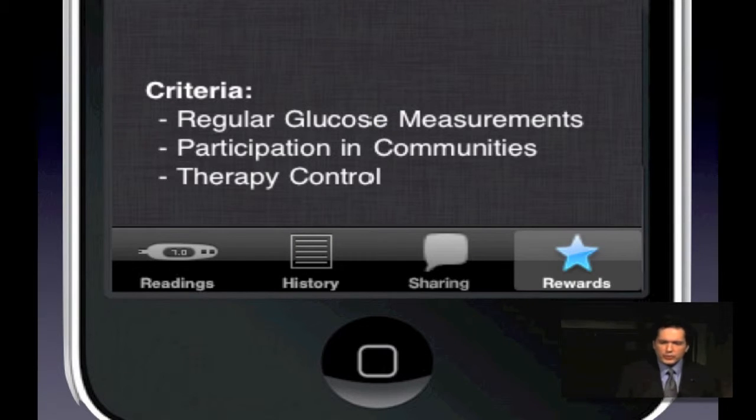So finally, we wanted to do rewards as an adherence mechanism. With the adults, we had automated phone calls that went to their home phone and would annoy them, but in the end they would adhere. We were pretty sure that wasn't going to work with adolescents. So despite the fact that Sick Kids has a terrific number of behavioral scientists who know the teenage adolescent mind, we said, well, what could we do? And interestingly enough, they said, well, you can just bribe them. And so that's what the rewards are.